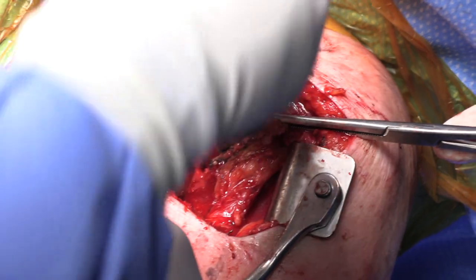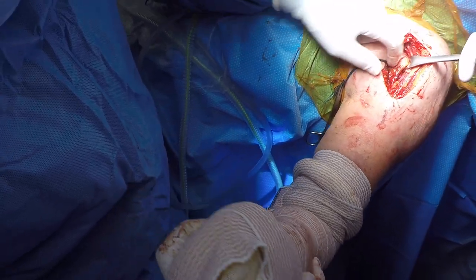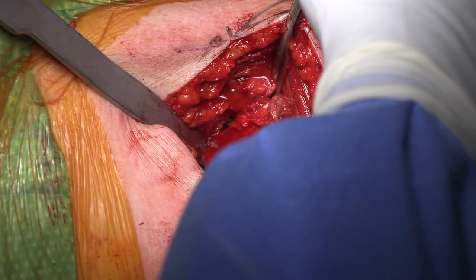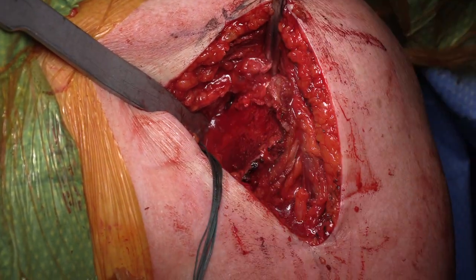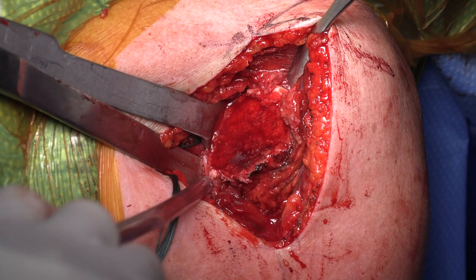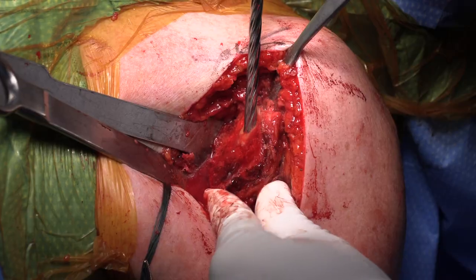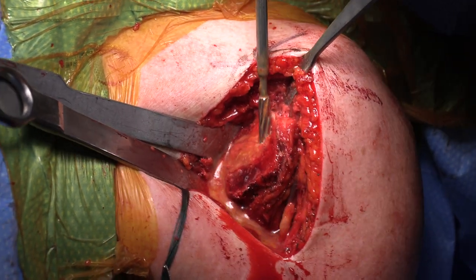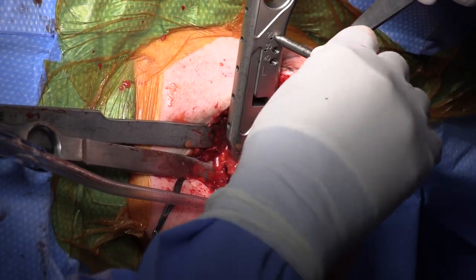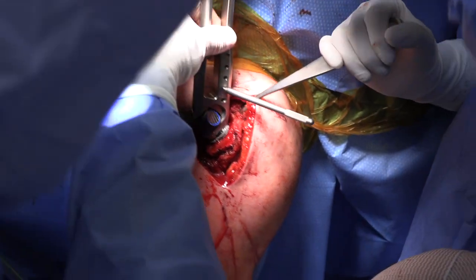The resected portion of the humeral head is removed and inspected. Due to the humeral head retroversion variability, the anatomic retroversion is assessed and corrected accordingly if necessary. With our experience, this method is quicker and more efficient than the standard head dislocation prior to performing the neck cut. The proximal humerus is translated anteriorly and placed in extension and external rotation. Posterior osteophytes are removed and the starting reamer is inserted into the canal, followed by sequential broaching up to the final broach, which is then replaced by the final prosthetic stem impacted into place for a secure interference fit.